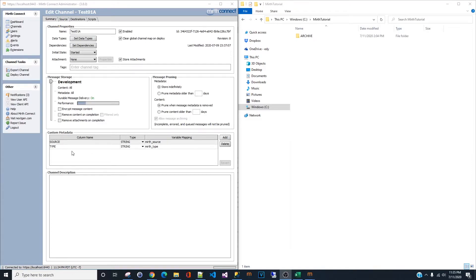Hello and welcome back to the channel. Today we are going to build a Mirth channel using a transformer in JavaScript to connect to a SQL Server database and output the report in a CSV file format.